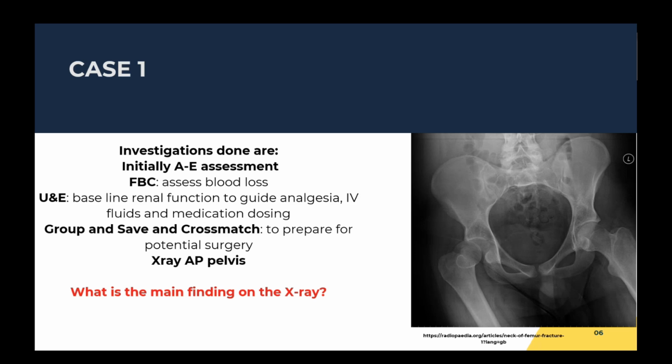Yeah, maybe X-ray of the hip and trauma lateral. Yeah, these are all very reasonable. And CT with bony reconstruction. Yeah. Okay, let me get that.